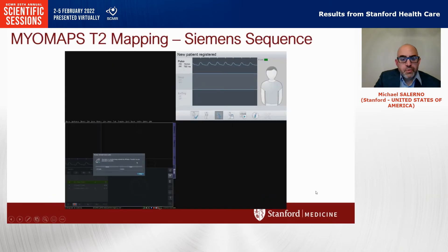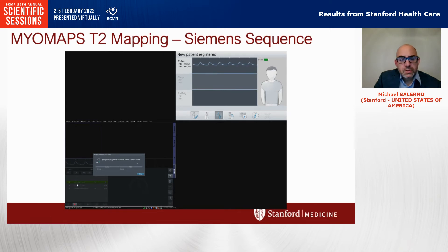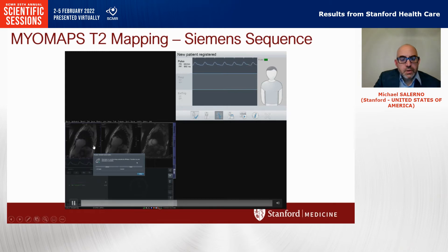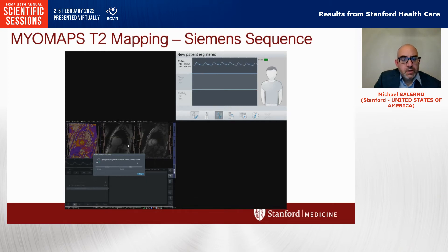Looking on the Siemens console, we see that it's running the T2 mapping sequence. The T2 maps are going to appear here in the console, just like they would if you were running it directly on the scanner.